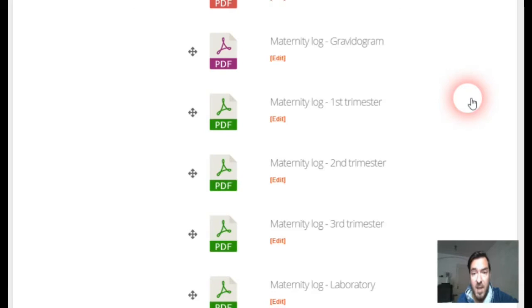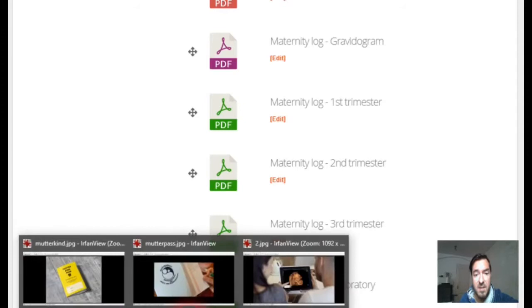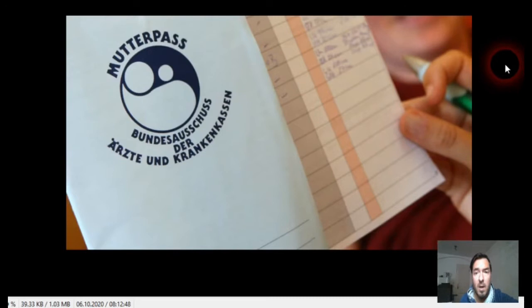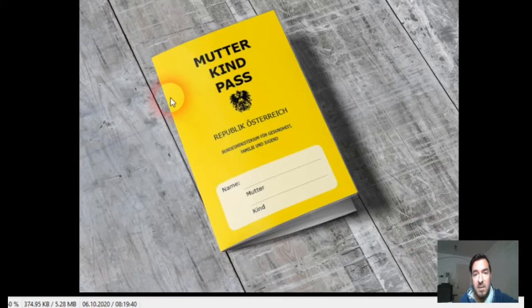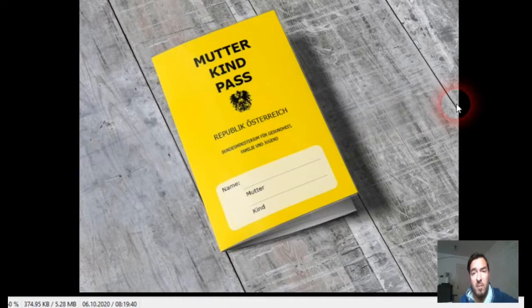What is the maternity log? It's a small — let's say — notebook. In Germany it looks like this, and in Austria it looks like this. It's a small notebook with all the relevant information for every examination during the pregnancy.